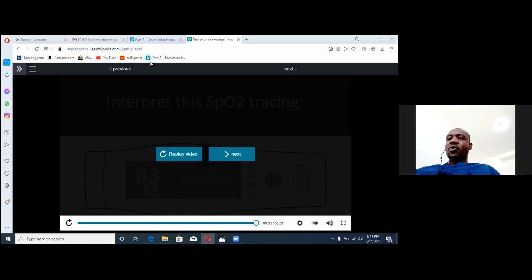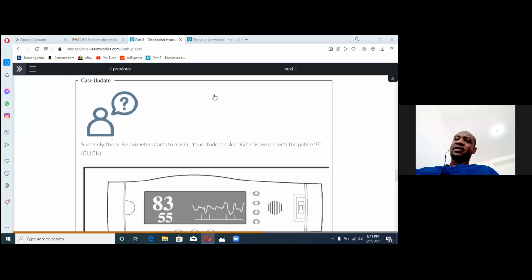So we are awaiting answers from participants. We've all seen the value there of the saturation, the heart rate, and the plethysmograph. So what do you think is happening there?